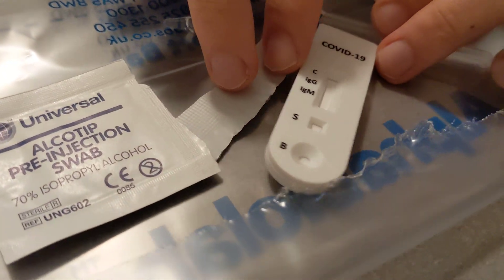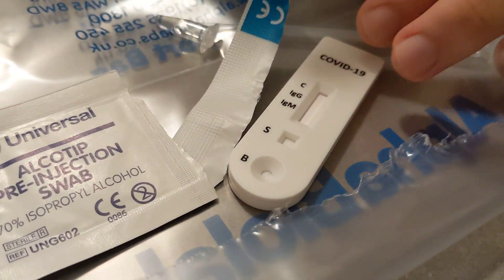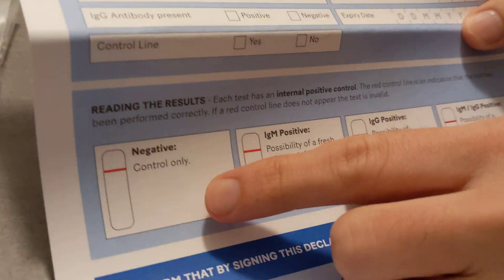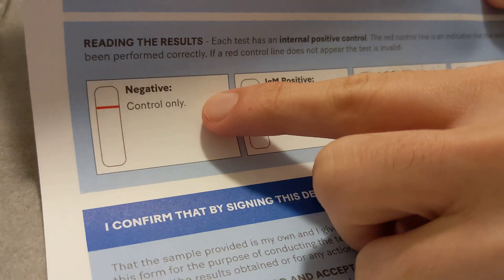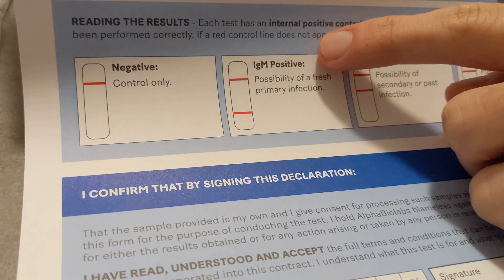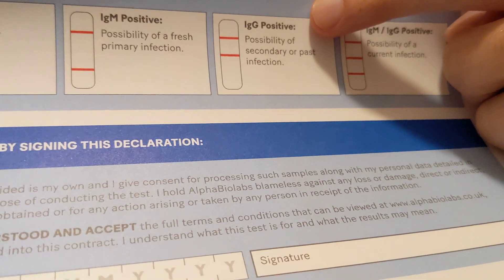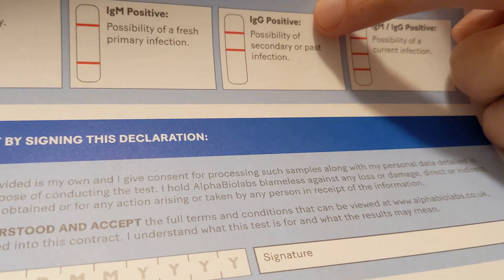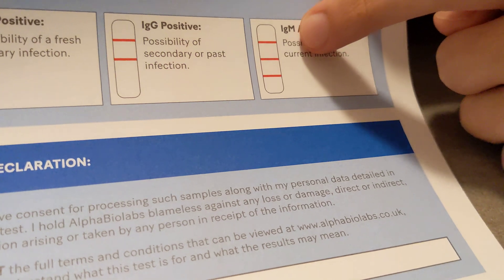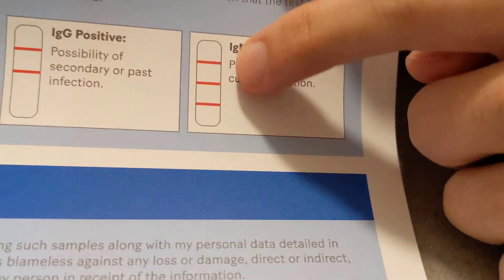And you can see from here: C, IgG, IgM. According to the result you can see here, if you get a negative result, you're only going to get one line. If you get IgM positive, you're going to have those two lines. If you get IgG positive, you're going to have those other two lines. And if you have both IgM and IgG, then you're going to get all three lines.